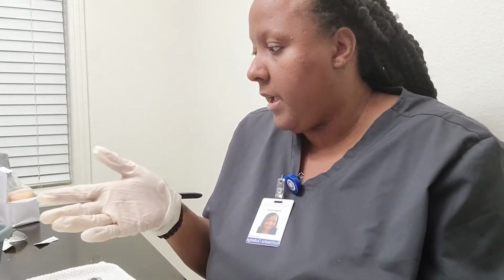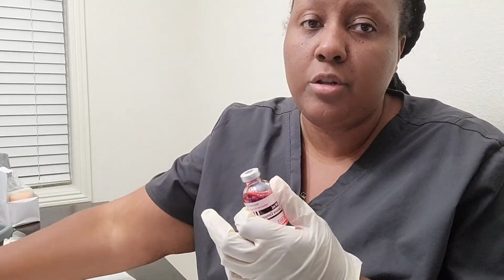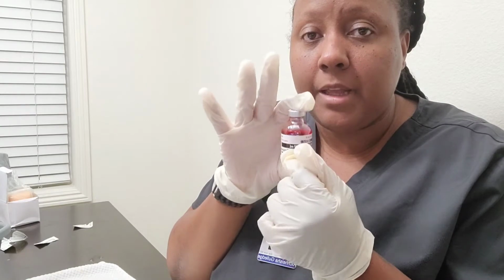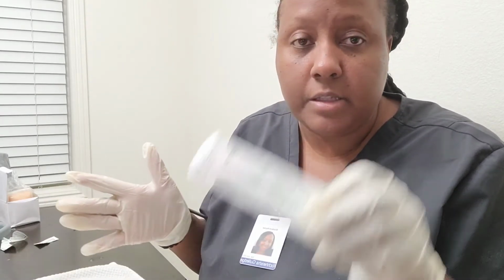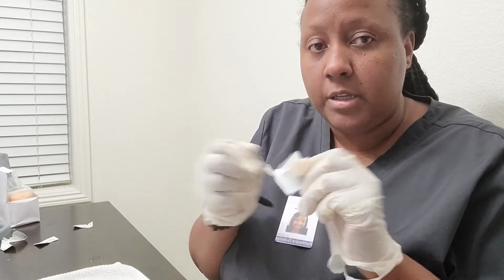And then also, besides the two insulins that I received, this is the only other vial that I received in my kit. So I am using this for my morphine. So just want to note that these are the only needles that I received into my kit. This one, and I want to notify the sizes, which is a 25 gauge and 1 milliliter. So as you can see, and I labeled here. Okay, and then I have 2 alcohol wipes, and I'm going to clean.